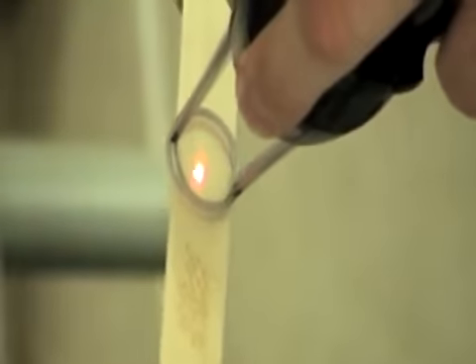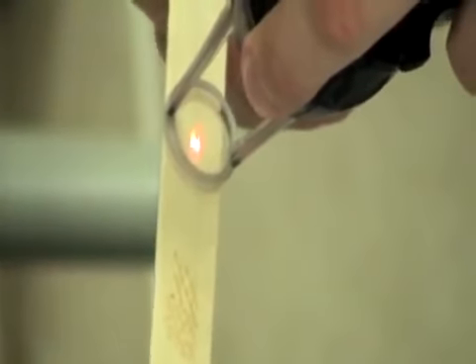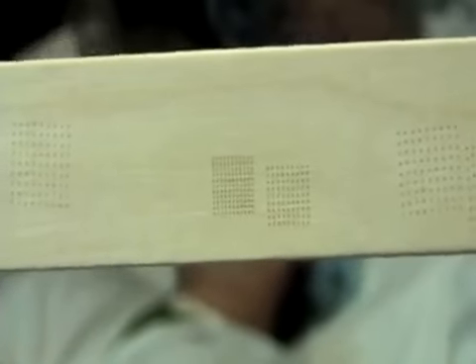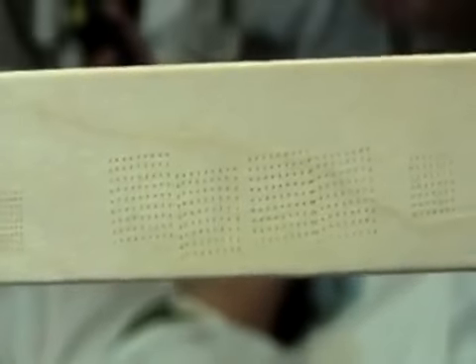The handpiece is tested out on a tongue depressor to make sure the depth of penetration and the density is proper. Here you can see the smaller spot size and the deeper penetration into the tongue depressor than the Active FX on the right.